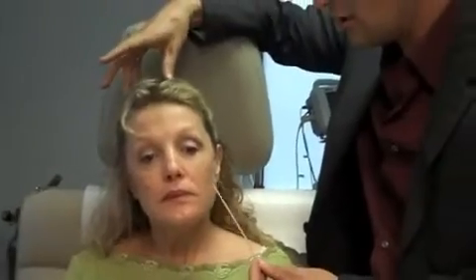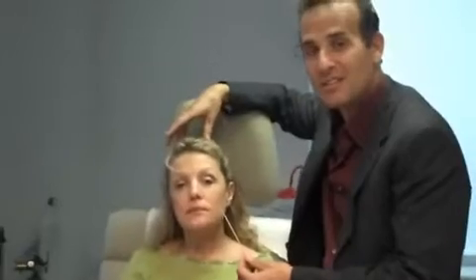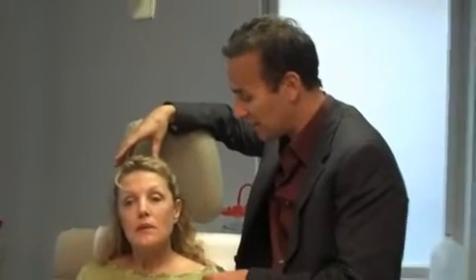Good. That was great. What's nice about this is that it's often combined with several things. Obviously, we're going to do some Botox on her today, but it's a great combination with Botox. I often use the filler facelift with Thermage skin tightening, what I call the FLT procedure, which stands for fill, lift, and tighten. What we do is we're using the fillers to actually treat the volume loss and redistribution. But what the Thermage radiofrequency device is doing is actually treating the lack of elasticity in the skin. So the Thermage and the filler facelift can actually be done on the same day as the FLT procedure, as it's coined as a whole.